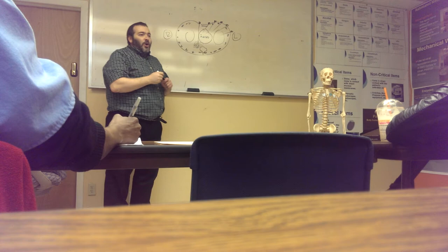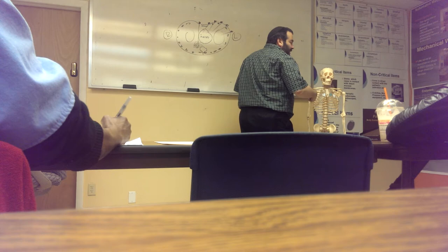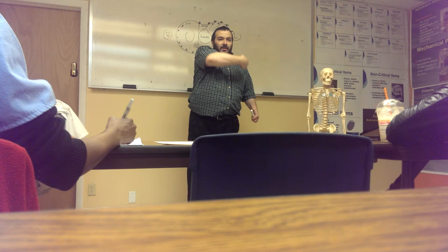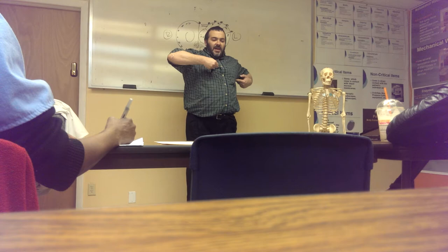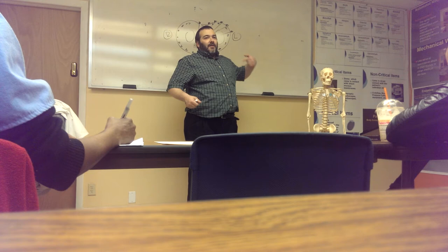So at first I looked at the heart this way, and now I'm looking at the heart that way. So I have this way, my lead one, two, three, AVR, AVL, AVF. And now, since I'm putting these leads, imagine looking from here, from there, from there, at the heart. So the first thing gave me a view from top to bottom, and now it's giving me a view from front to back.